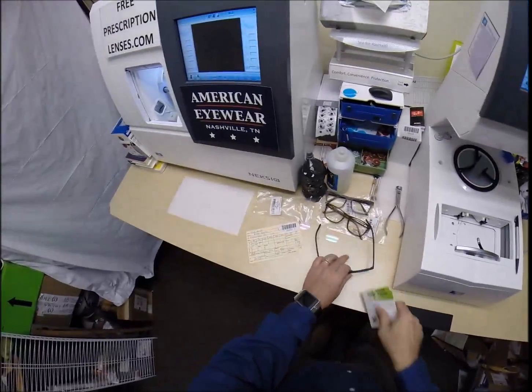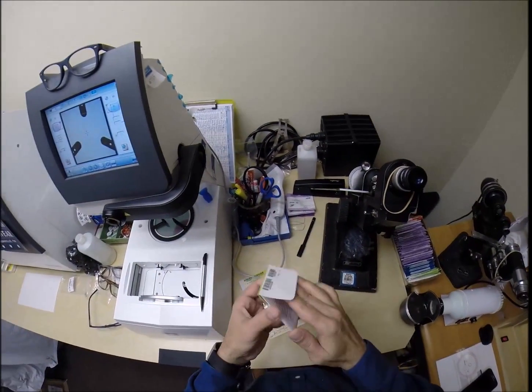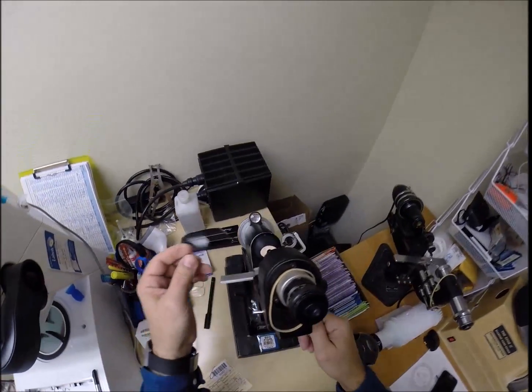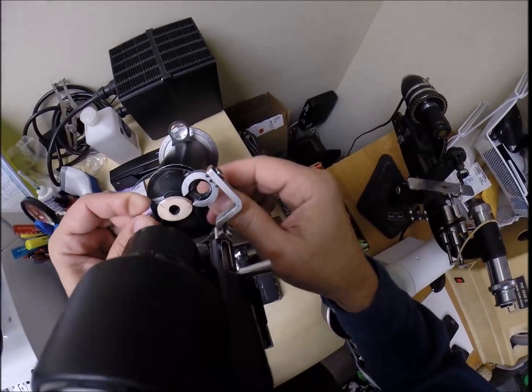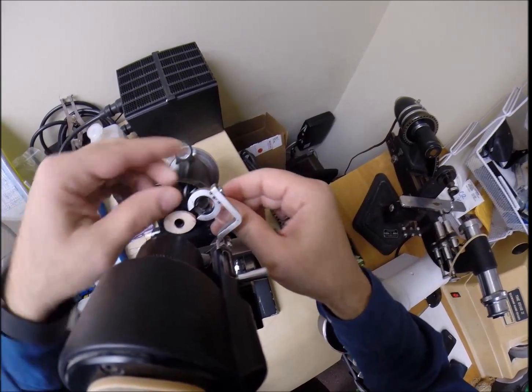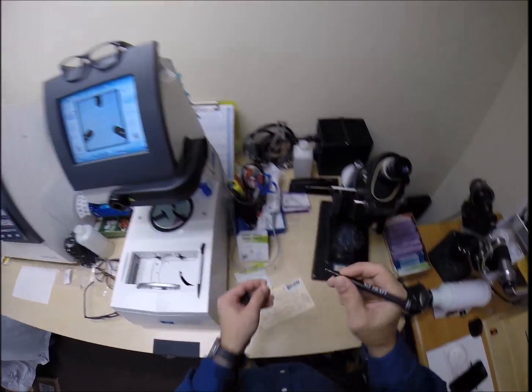So let's come down here. Your right eye reads plus 50 sphere, no astigmatism correction. I'm going to take your lens out of the protective packet, put it in, and make sure everything is turned on. Put it into my Marco 101 lensometer, put the power drum on plus 50. Normally if there was any astigmatism I would rotate the lens, but you have the same power all over the entire lens, so I'm just going to find the optical center of the lens and place one dot in the center. This is the right lens.